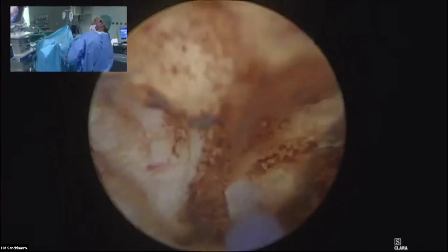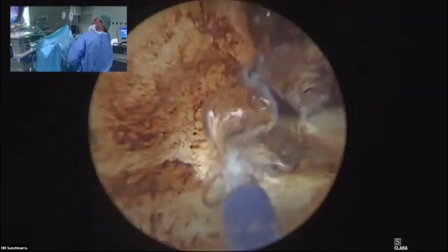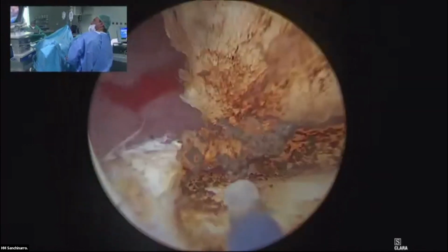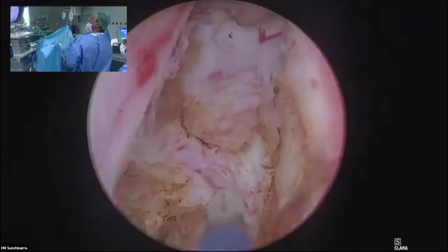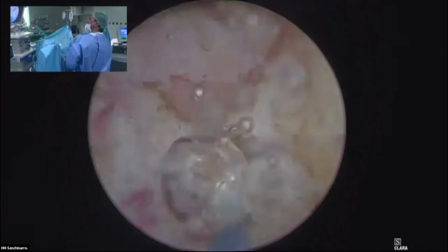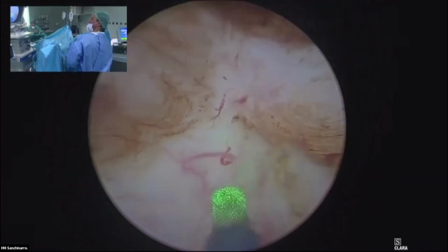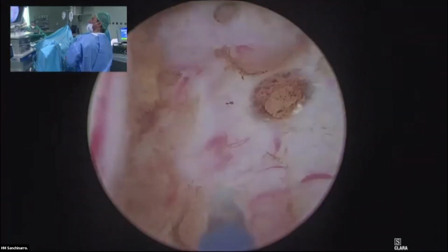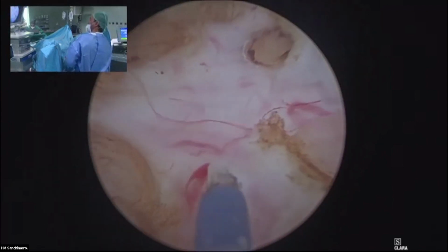I said that when you go below the bladder neck, it gets hard to control the bleeding or space. Then you have problems with the catheter, maybe. Yeah, absolutely. So just keep in mind this.